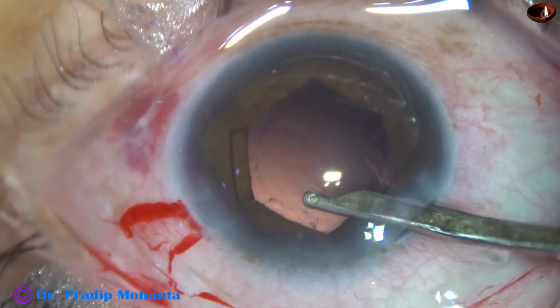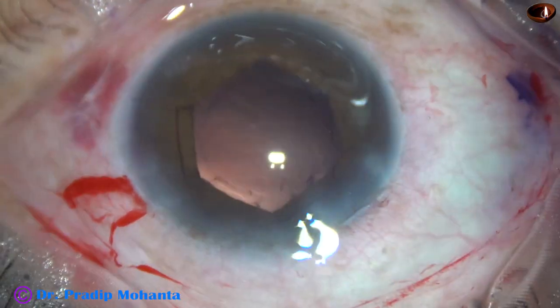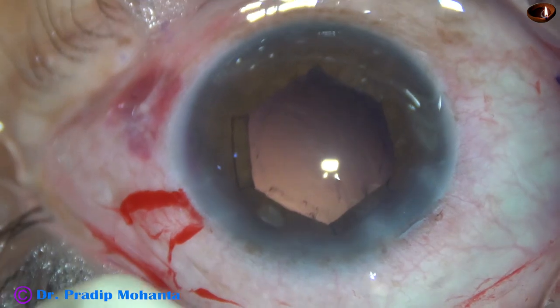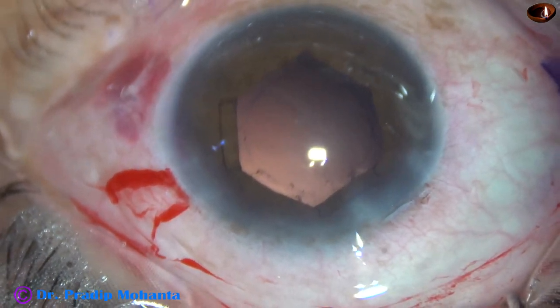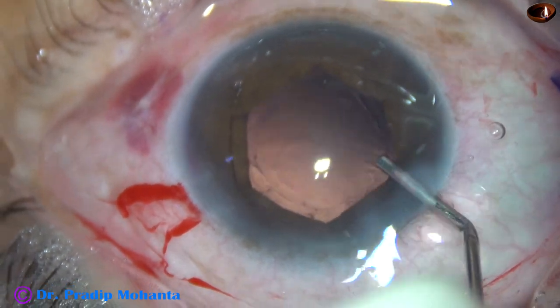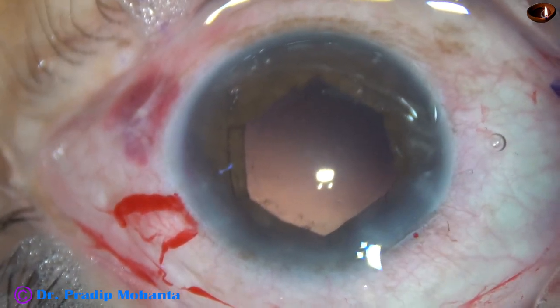The rhexis is very good — it is almost circular. And the posterior capsule is clean. There is no cortical fibres sticking to the posterior capsule — no Elschnig pearls.